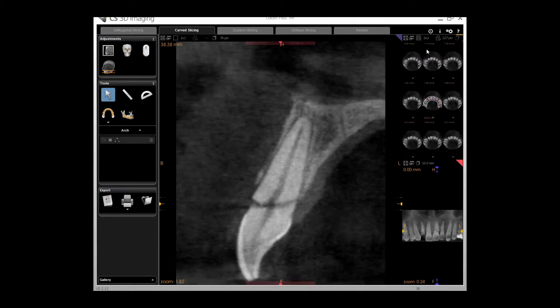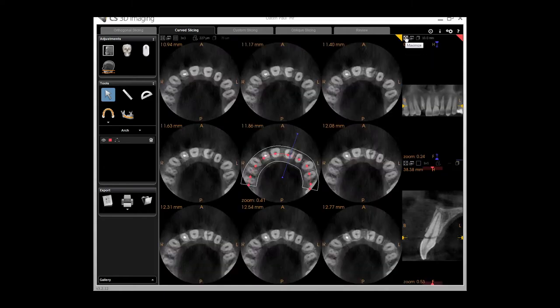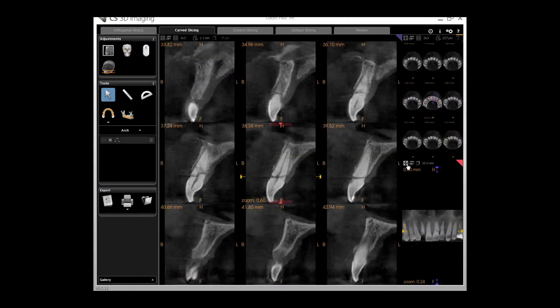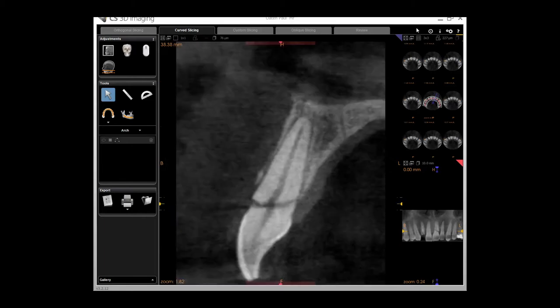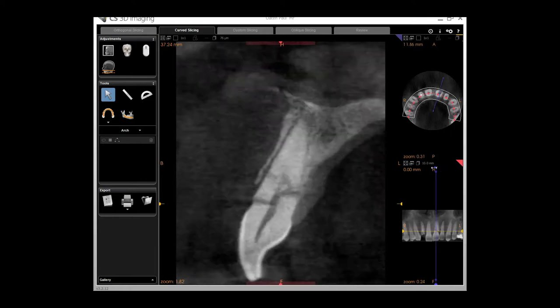This is the cross-sectional view now. I can look at this in multiple different views, as I did in the previous scan, to get a feel of how things are progressing across the scan. You can see how useful that is in this case with the fracture — I can look at the individual tooth in different thicknesses, and I can change the thickness between the slices to give lots of different viewing options. This will take some practice but it is definitely worth it, because the software here is very helpful.